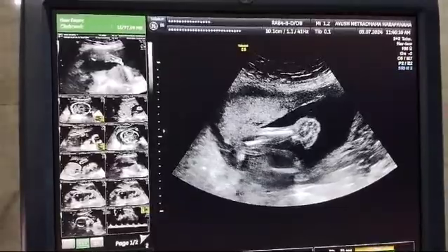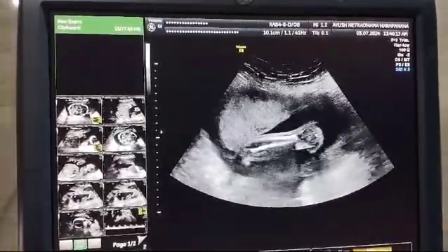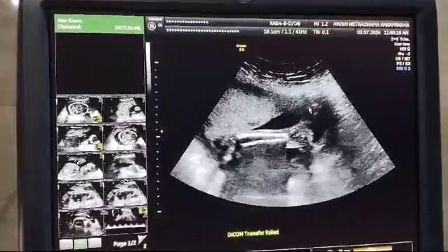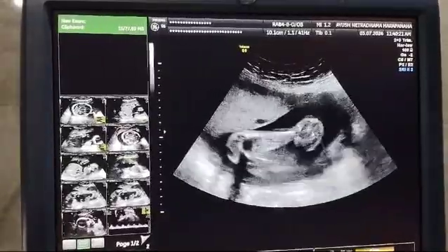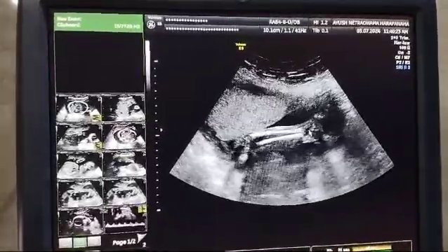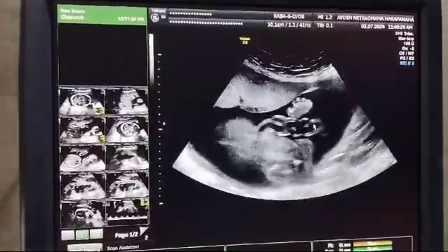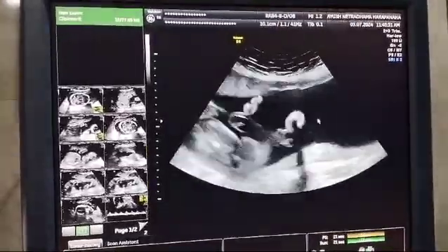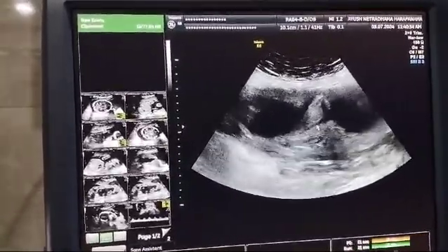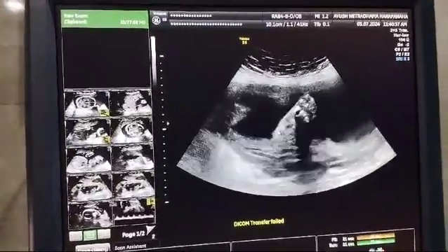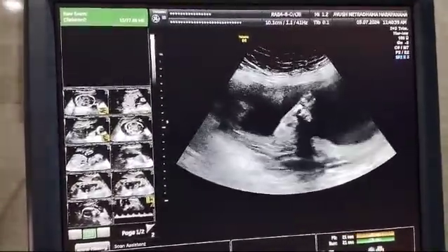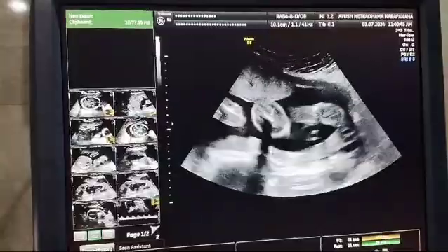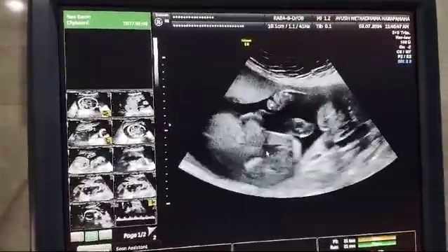You can clearly make out the club foot here — this is the tibia and fibula, and we don't see the foot at 90 degrees. With the tibia and fibula in focus, we see this type of clubbing. This is the club foot, whereas on the other side the foot is normal. You can see the sharp medial margin, the great toe, the heel, and the tibia and fibula on the normal side.